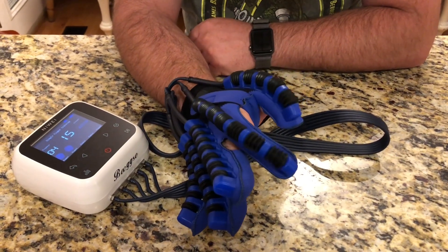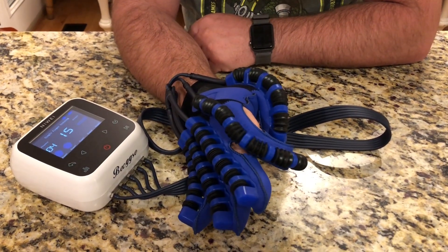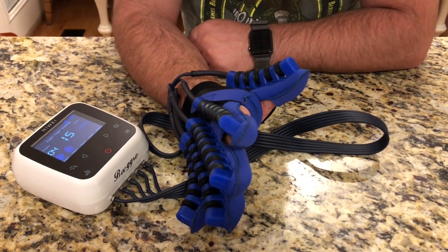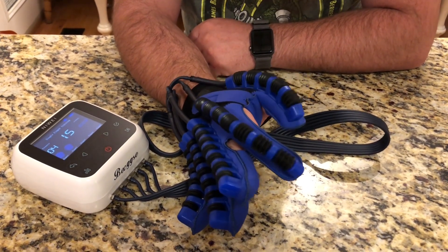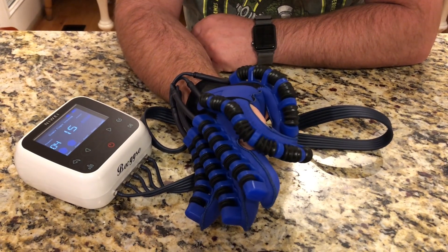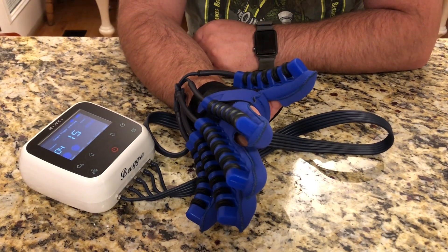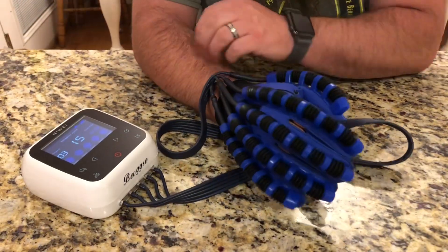I went ahead and turned on my thumb and my index finger, and you can see it is now doing both fingers. So you can do one finger or multiple fingers — this is a really nice mode that lets you adjust exactly what you want to work on.